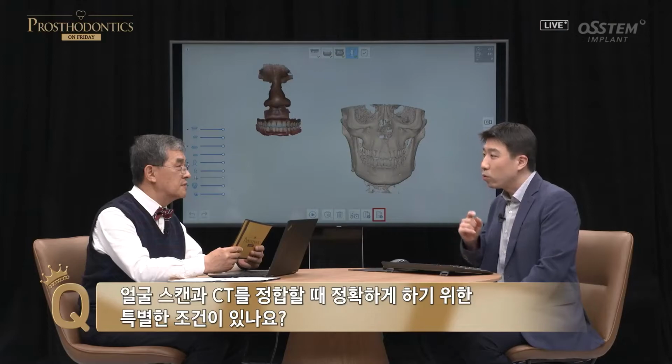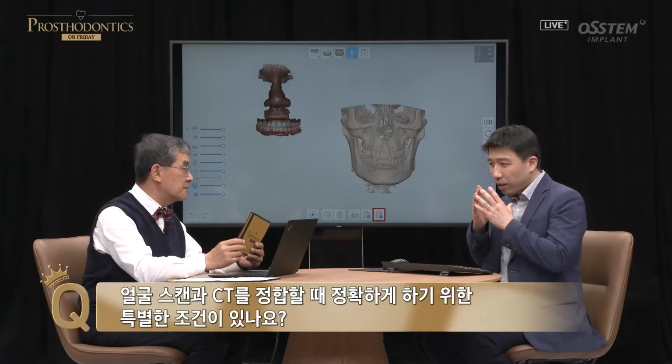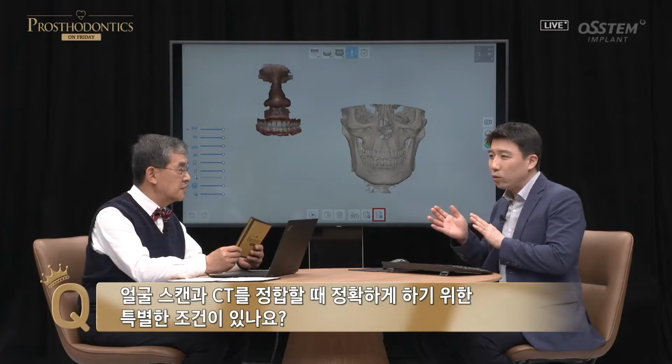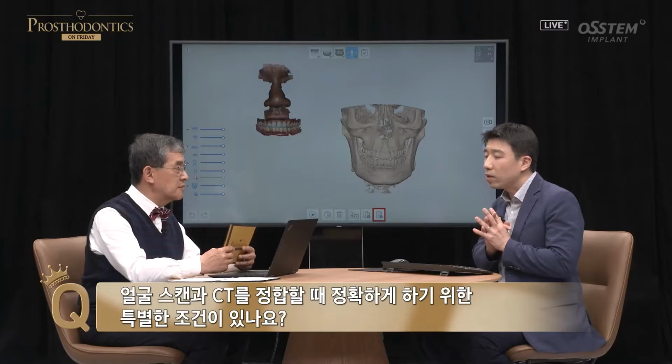As you mentioned, the CBCT and facial scan data, it's actually soft tissue and hard tissue data. It would be nice if X-ray could express soft tissue, but in normal cases, it doesn't. That's right. It focuses on hard tissue. Even in the slide that you see, the teeth are the common denominator. In the case of CT and facial scan data, you need to have facial scan data with teeth exposed. You need to use that to merge with CT. You use residual teeth as the standard for merging.